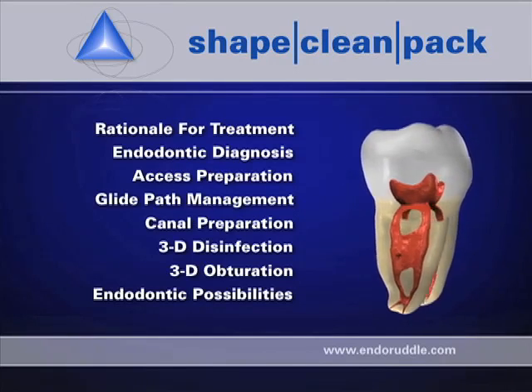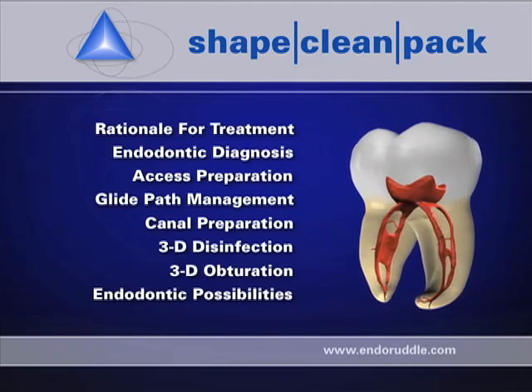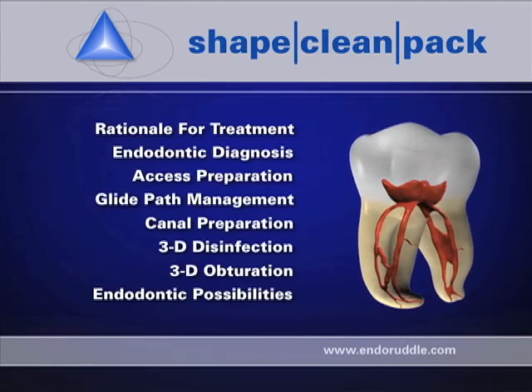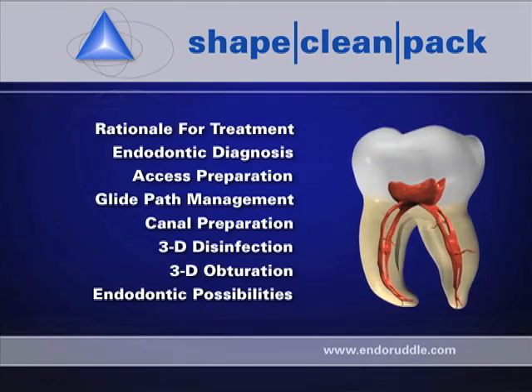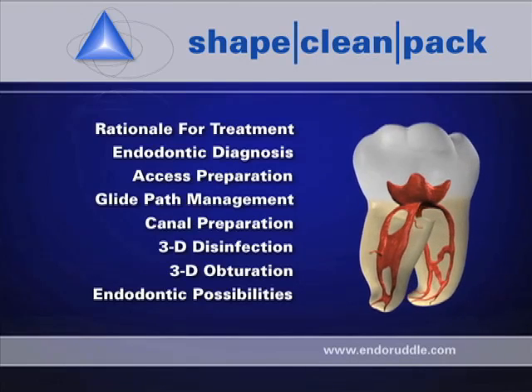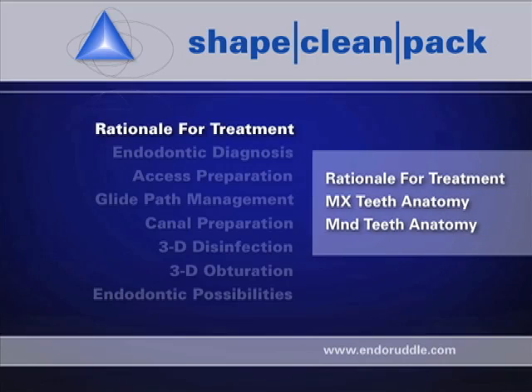But if we actually do these 6 steps, from diagnosis to access to glide path management, shaping canals, disinfecting and filling root canal systems, then if we do those steps properly, you can look at some clinical cases to see how it all comes together in kind of an exciting way. Let's get started. First, I would like to look at maxillary teeth anatomy, and then we'll look at how the various steps were performed to get the results that I'm going to show you.